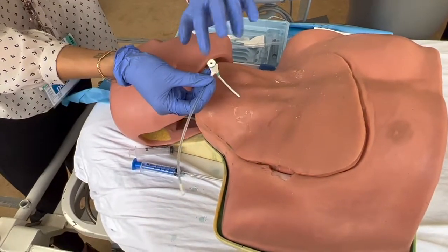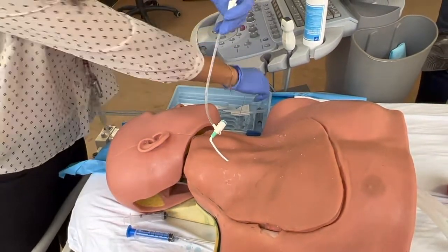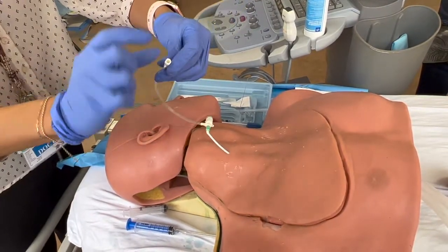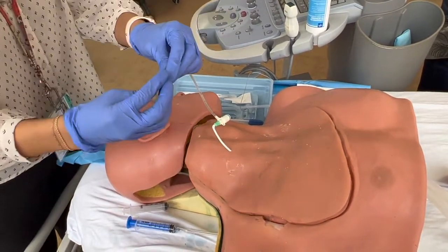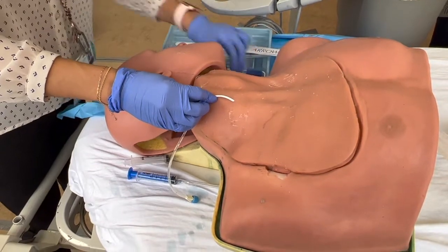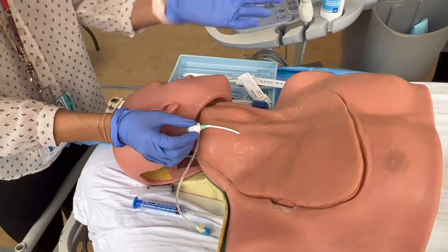At this point, blood is just going to come out of here as you can see. Ideally you would have a flush ready to go and then flush the entire thing. If you're ultra prepared, you'll have one of those blue caps to put on the end as well, but if not, you can just replace the blue cap it comes with after you've flushed it. There is suture material in here — you have a straight needle, take it out, suture it through this little hole, and then slap the dressing on it. And that's it.